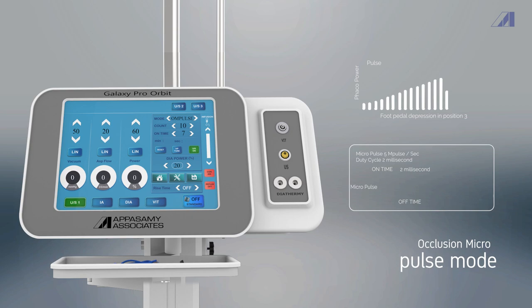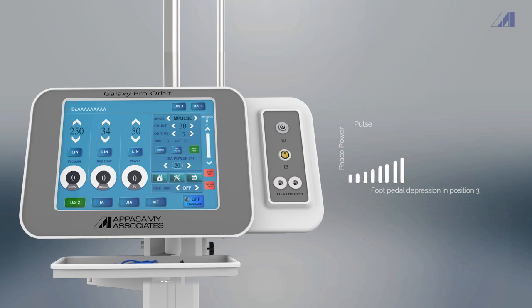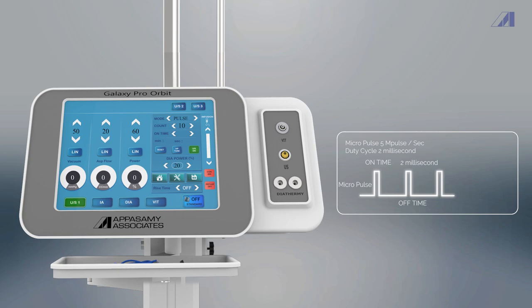The other important mode is Occlusion Micropulse mode. This is a combination of existing technology and latest technology as it uses both the Pulse mode and the Micropulse mode. This mode starts with the Pulse mode and once the cataract is occluded, the machine automatically goes to the Micropulse mode, reducing the treatment time significantly.